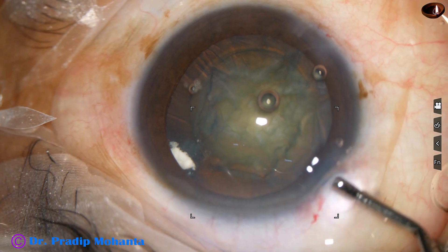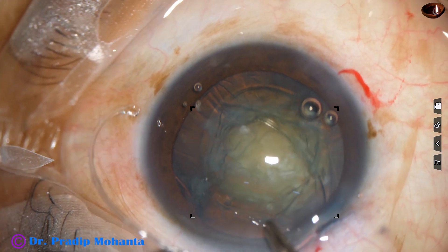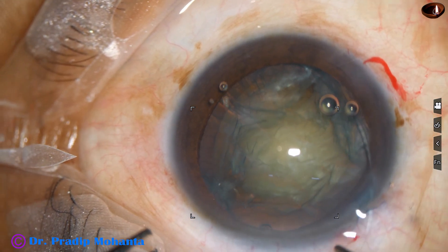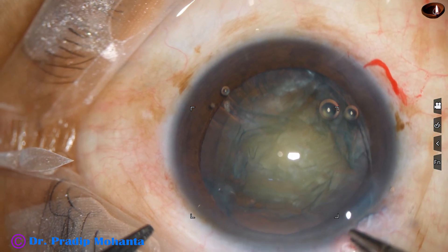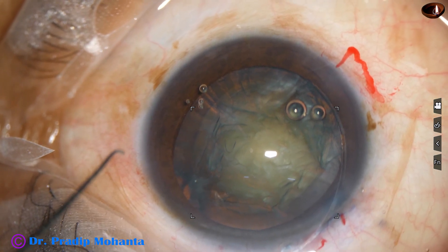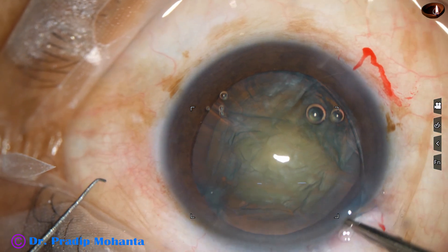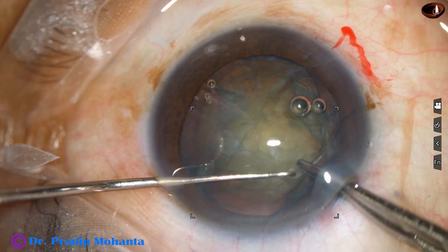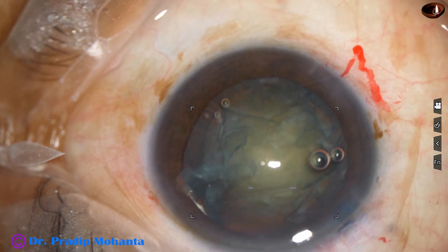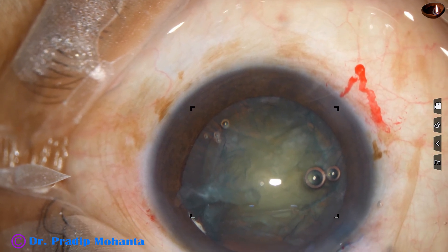I inject Viscoat — see, as I inject Viscoat, it goes back. Now my plan is to place the CTR capsular tension ring in the capsular bag. The leading end has gone into the capsular bag. For the trailing end, I take Macpherson's forceps, hold the trailing end just very near to the opening, take the trailing end inside, and use the Sinskey hook. The prong of the Sinskey hook goes into the opening and dials the CTR into the capsular bag. If the Sinskey hook gets stuck, we use another hook to press over the CTR.